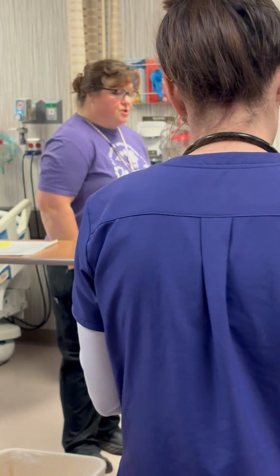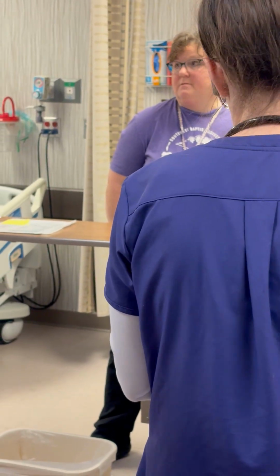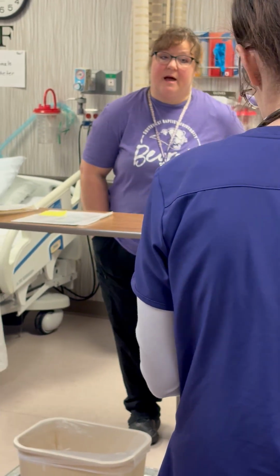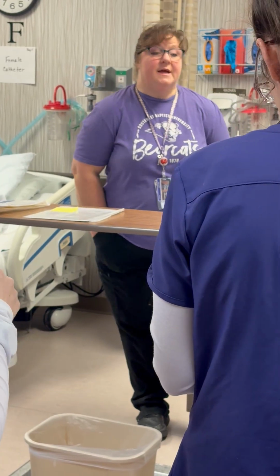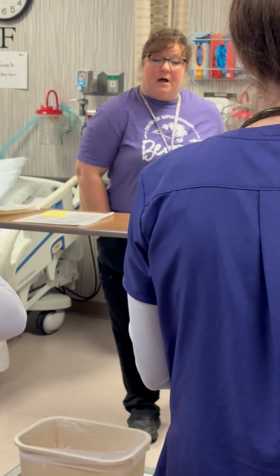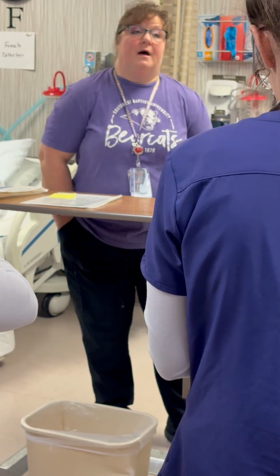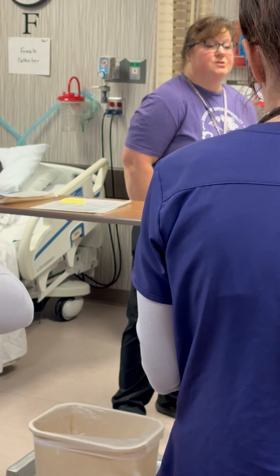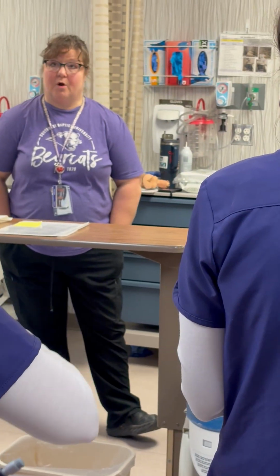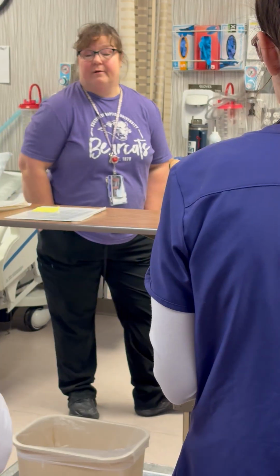Then you need to make sure that you're telling your patient what's going to happen, all right? Your doctor has now ordered a Foley catheter. It's a tube that's going to go into your bladder to drain your urine, because we need an accurate amount of urine, okay, and so that you stay nice and dry, all right? Whatever reason the doctor has for ordering that Foley catheter.